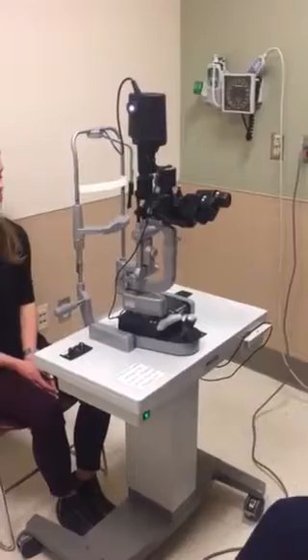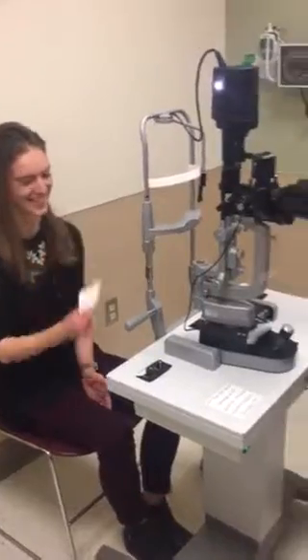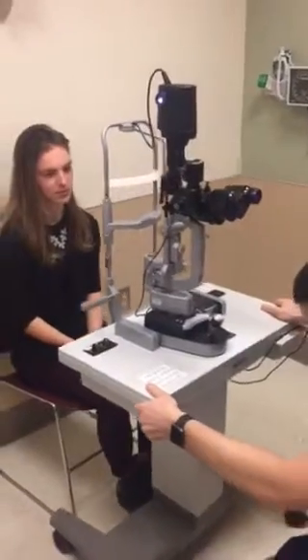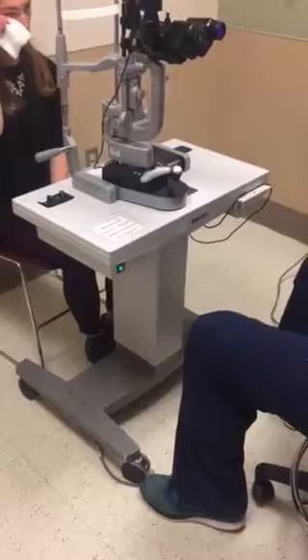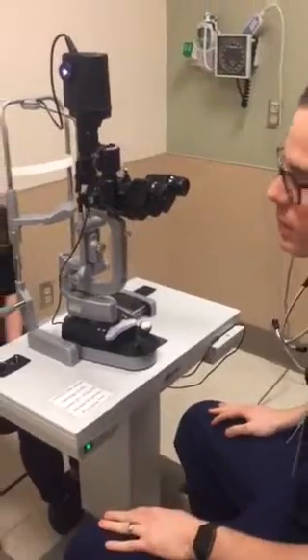You can also give the patient a gauze or tissue for their tears. Now that you have that done, wheel the slit lamp in front of the patient and lock the wheels. You need to make adjustments to the height of the slit lamp as well as the chin rest, and instruct the patient on appropriate positioning.